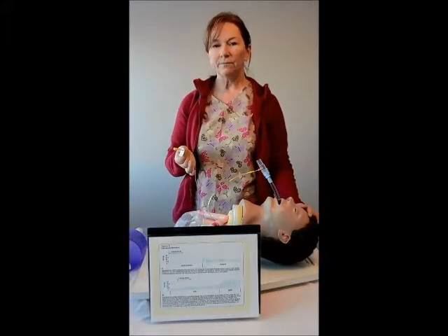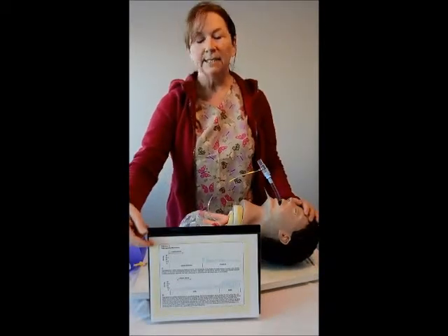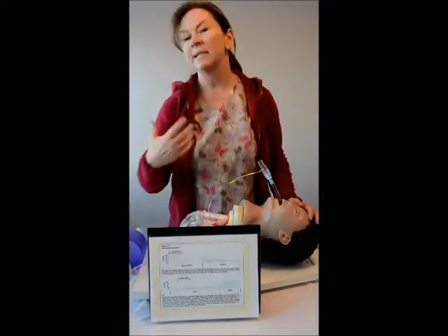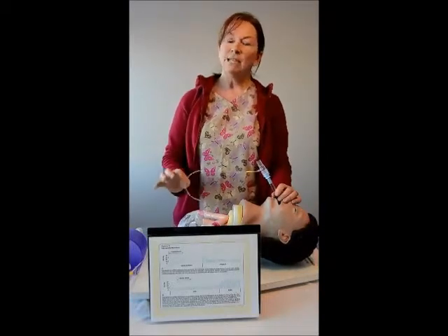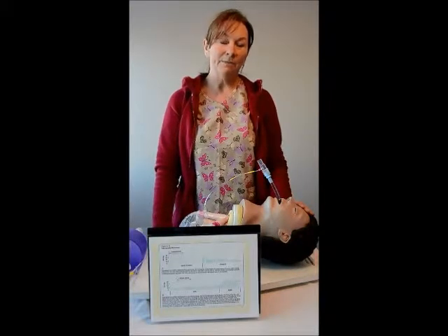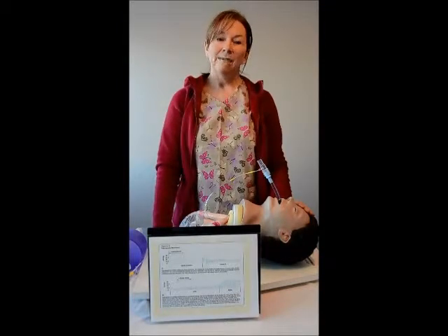That's the amount of end-tidal CO2 or carbon dioxide being exhaled in a patient who has a spontaneous circulation. Now, should this patient suddenly become pulseless, what you will see on your end-tidal CO2 is a value of 0. Okay, so you assess your patient, you do your CAB assessment, circulation, airway, breathing, and if the patient has no pulse, that is associated with an analysis of 0. There is no carbon dioxide being exhaled because the patient not only is not breathing, but they have no pulse.